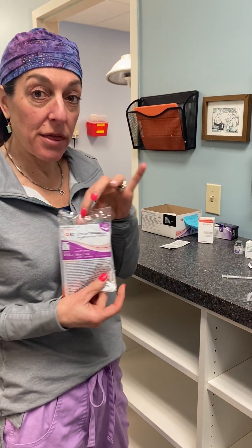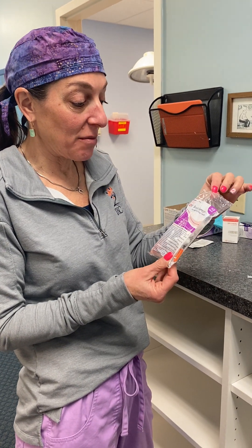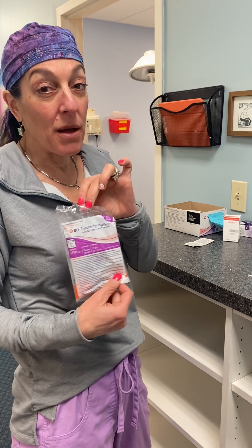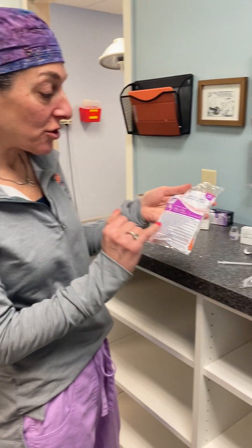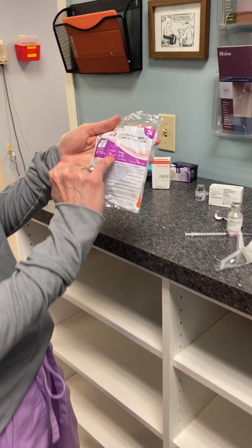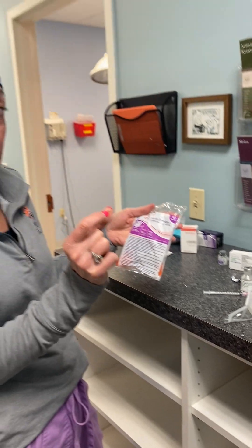We inject Botox with BD insulin syringes — the BD Ultra-Fine. They were hard to find for a while but are back in stock. Make sure you're getting the 8mm or 5/16-inch length needle. Sometimes these syringes come with a longer needle, and you don't want that when injecting the face.